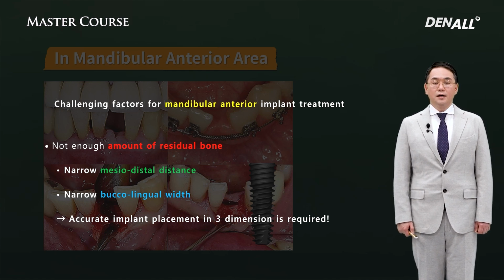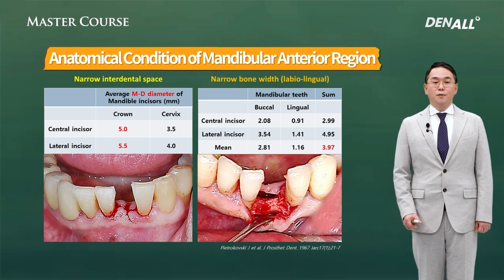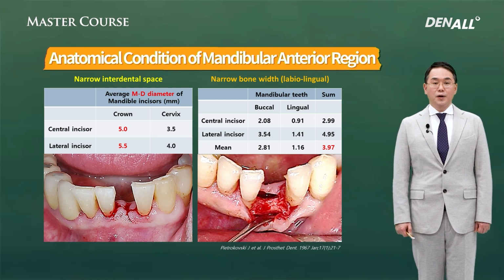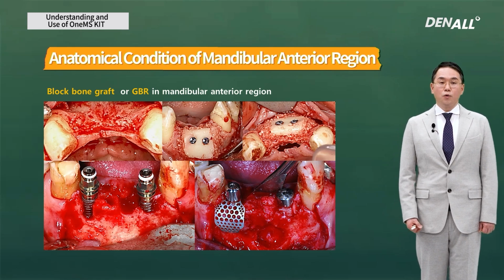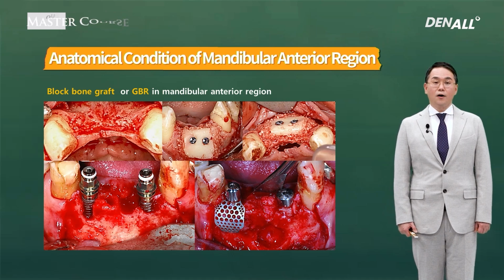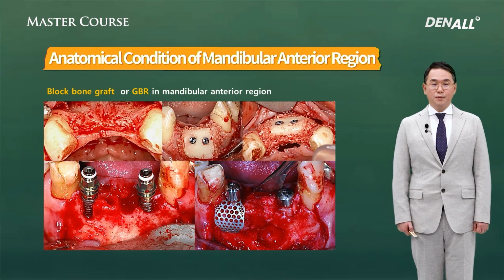In terms of drilling and angulation, the anterior mandible is like this. The bone width is very narrow and the mesial-distal distance is limited. The primary cause of extraction is periodontal disease, so you will encounter bone defects frequently. So placing a normal two-piece type implant would require block bone or GBR procedures in addition to the placement.